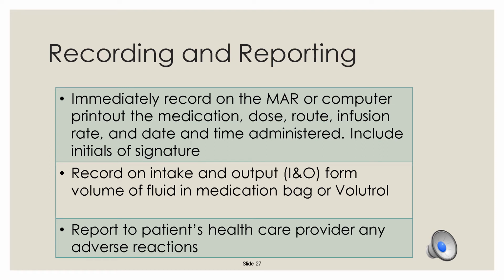You want to always remember to document that you gave the medication on the MAR or computer printout. You want to record intake and output of the volume given in the medication bag or the Volutrol, and you're going to clear those IV pumps every 8 hours unless it's something else. And if there's an adverse reaction to a medication the patient's receiving, you need to report that to the healthcare provider.